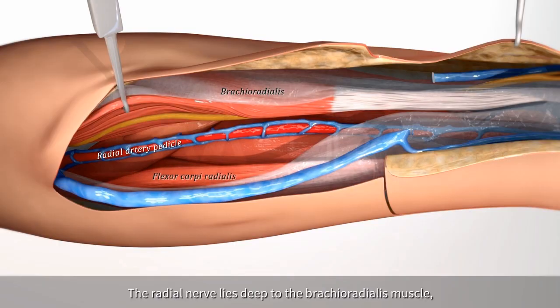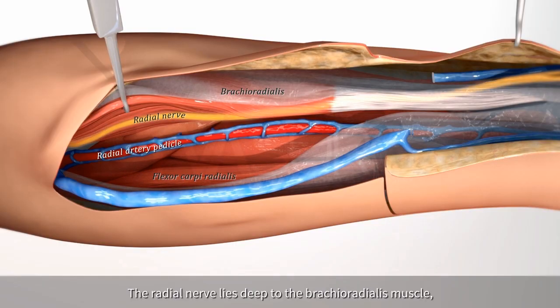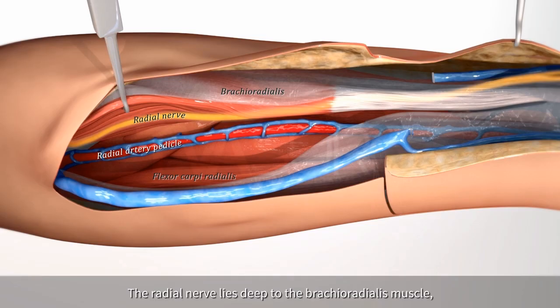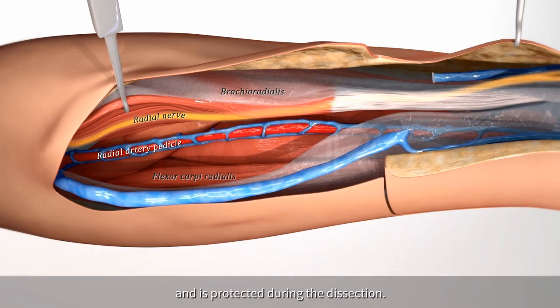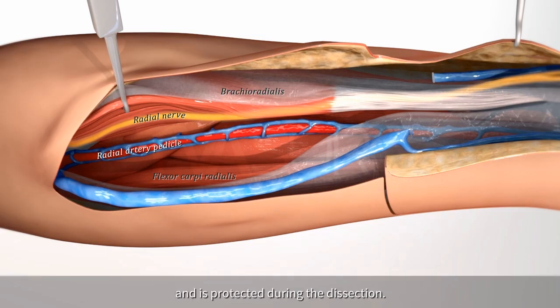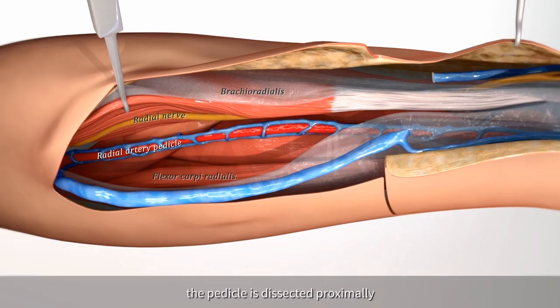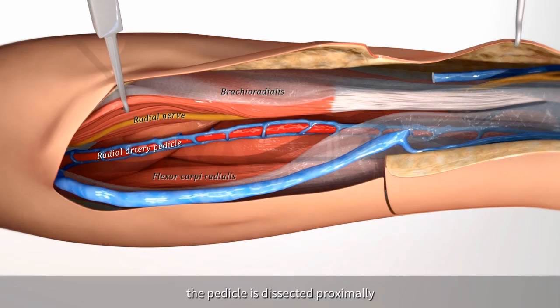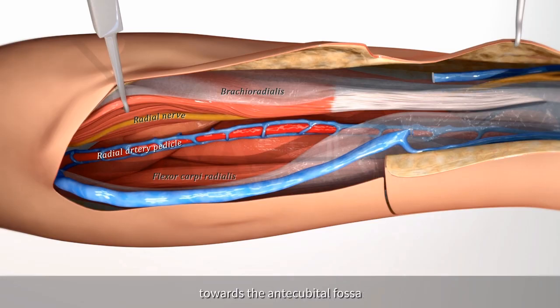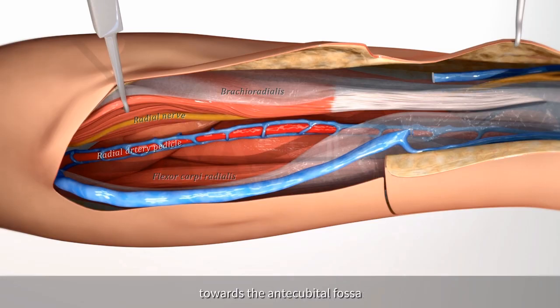The radial nerve lies deep to the brachioradialis muscle and is protected during the dissection. Once visualized, the pedicle is dissected proximally towards the antecubital fossa.